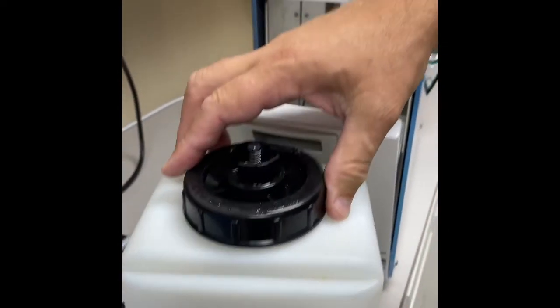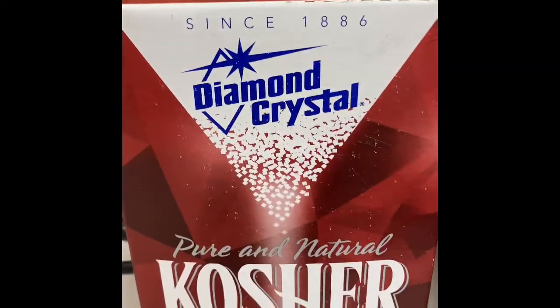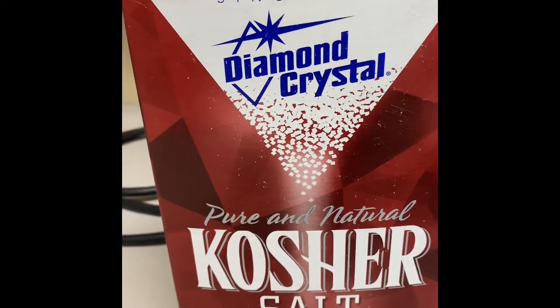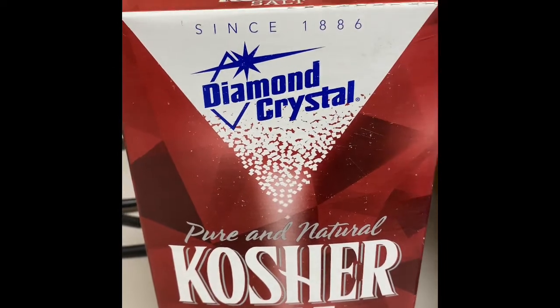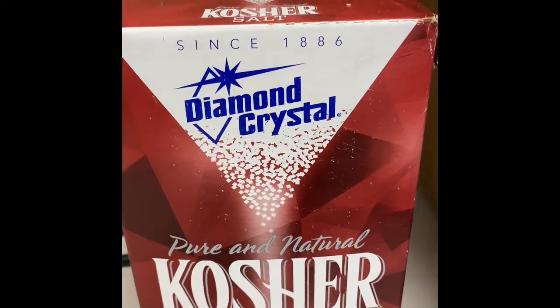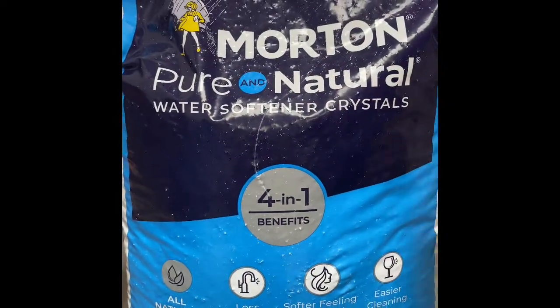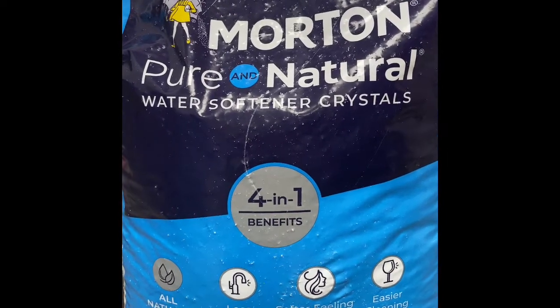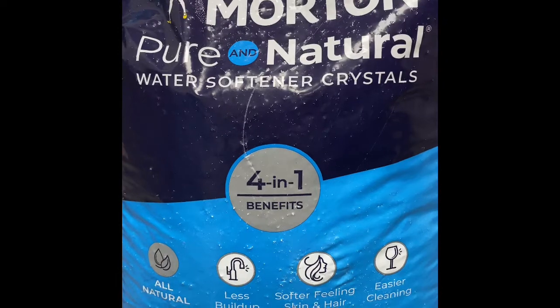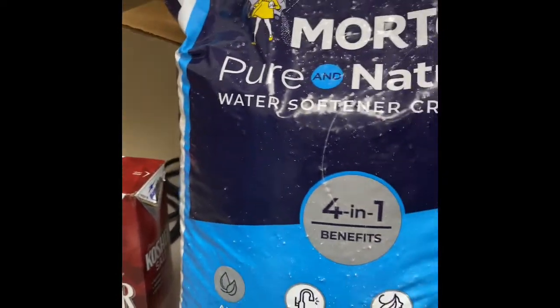Let me give you an idea of what kind of salt to use. You can use kosher salt, non-iodized — something you can pick up at a local grocery store, Sam's, or Costco — very easily available, maybe two or three dollars a box. Or you can use what we use now: Morton Pure Natural water softener crystals. This is a great salt to use, and you can buy it at Lowe's hardware stores or find it online as well.